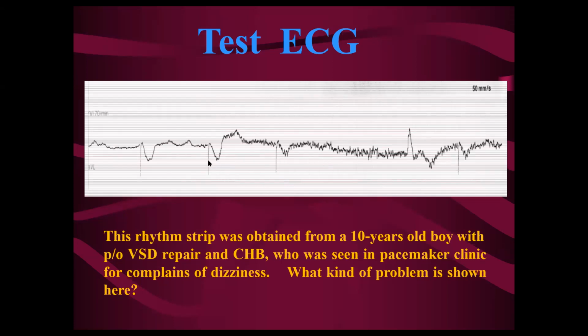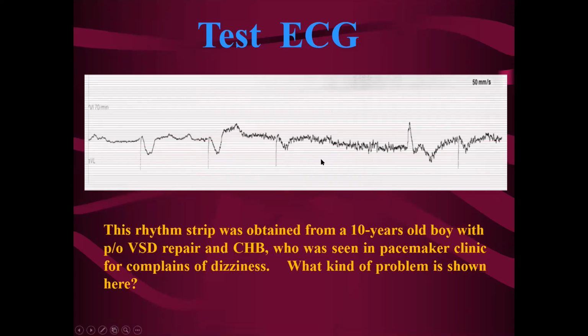Well, so here is where we're expecting the next pacing spike to be. So this is the pacing interval. This is the pacing interval. So we expect the next spike to be here. And the spike is pretty big. So if it was delivered, we should have seen it, right? But we didn't see it. So if you don't see a pacing spike when you expect you should, then the pacemaker must be oversensing something, right? If it oversenses something, it's going to inhibit from the pacing.